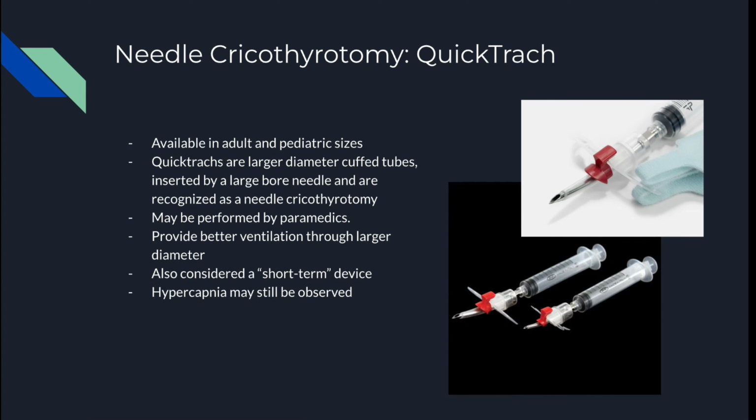So while you're still not going to be able to ventilate through it as well as if you were to stick an ET tube or a Shiley or something through the membrane, you're going to be able to ventilate better than you would through your typical angiocath. Okay, so the device itself really is a better option. It's also considered to be a short-term type of device, and we should still expect to see some level of hypercapnia.